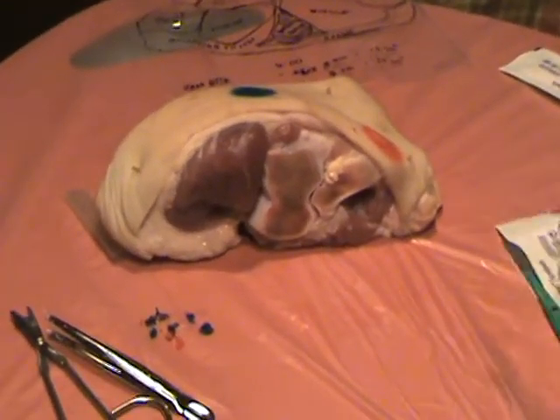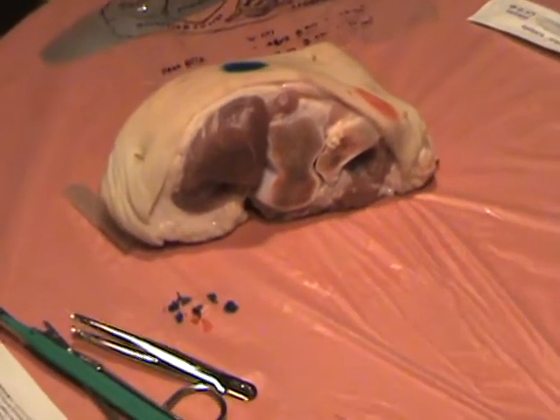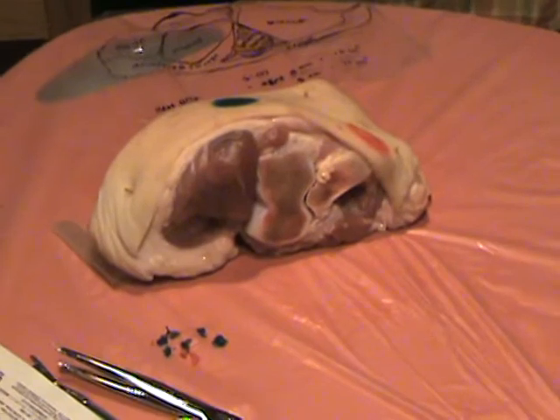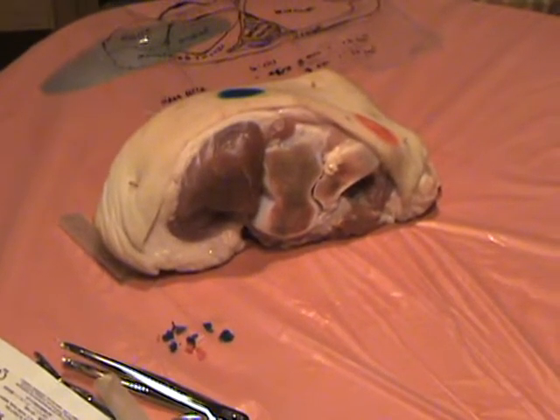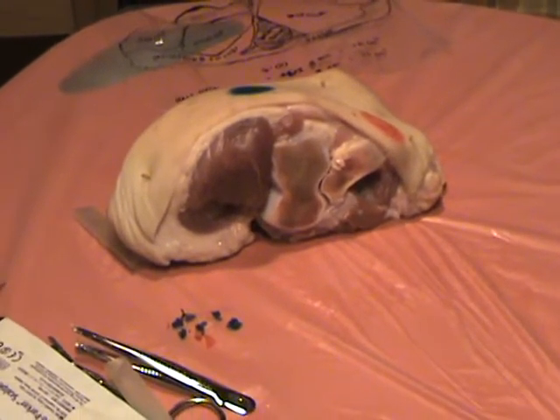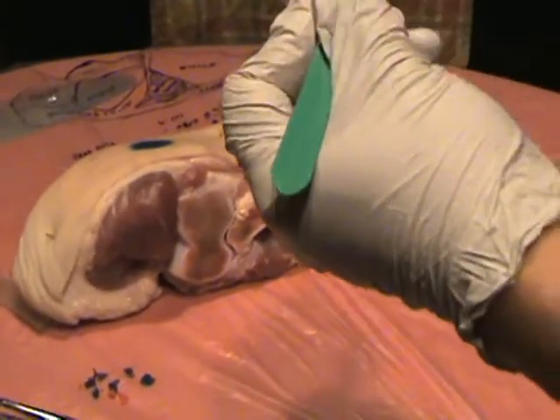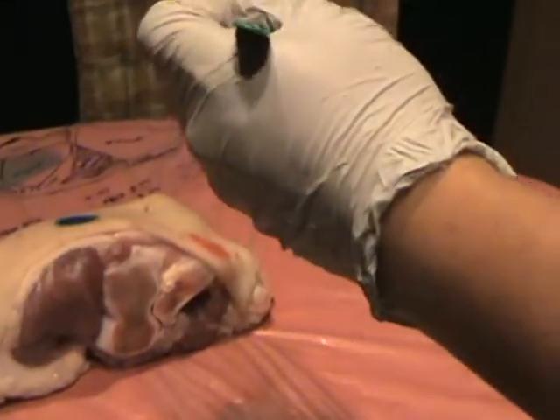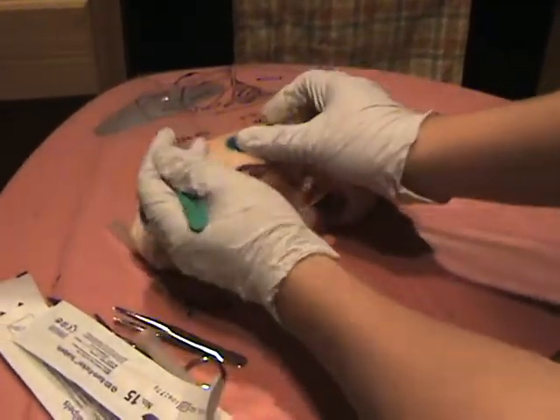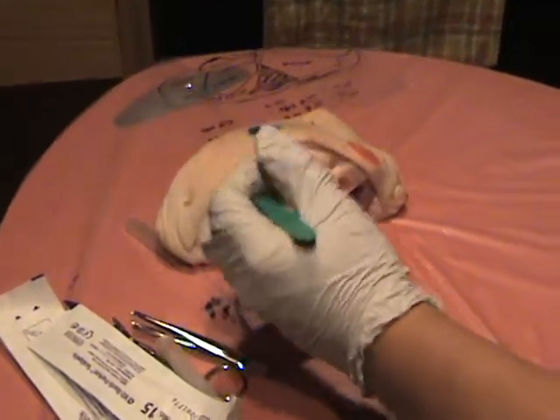Next will be cross hatching. We'll be using number 15, and still my dominant hand will be my left hand. And so the scalpel will be firmly on the first web space. It's gonna be held like a pencil. And the one that should be cutting over the blue spot over here is the curve of the blade, not the tip. So we have a better control.